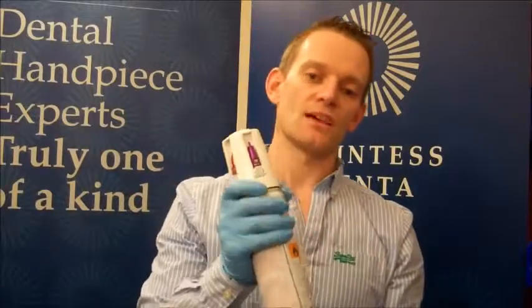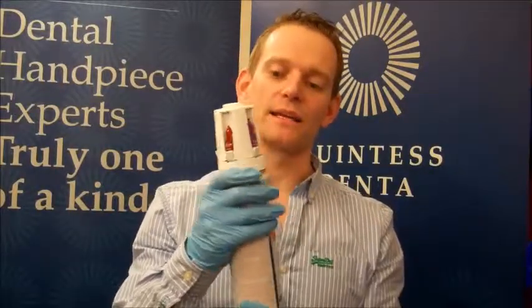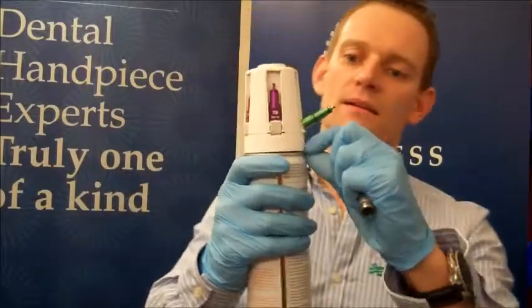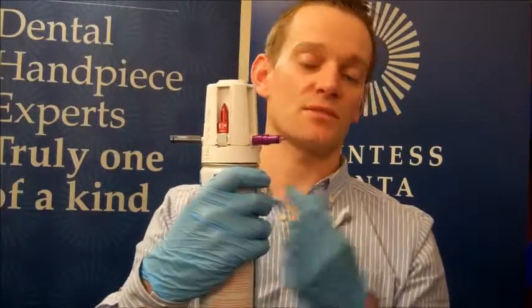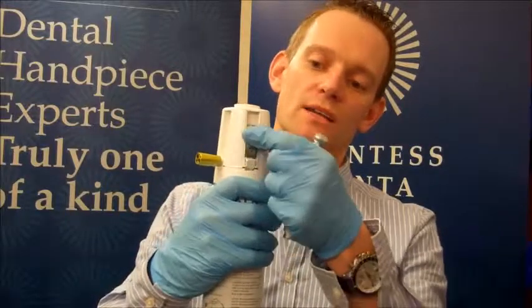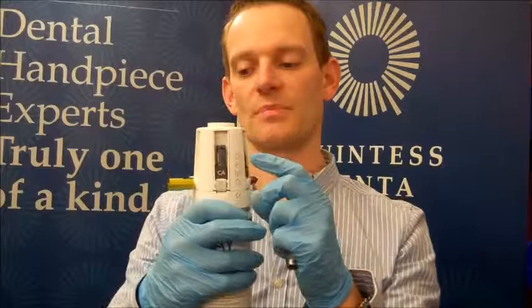So first of all, take a good quality lubricant oil and shake it vigorously. This mixes the propellant gas and the oil inside. Now this device is called an easy oil, and you can lubricate up to 3 different high-speed connections with this if you have more than one connection in your practice. You also have a contra-angle nozzle, and you also have a nozzle for spraying into the chuck of the handpiece.